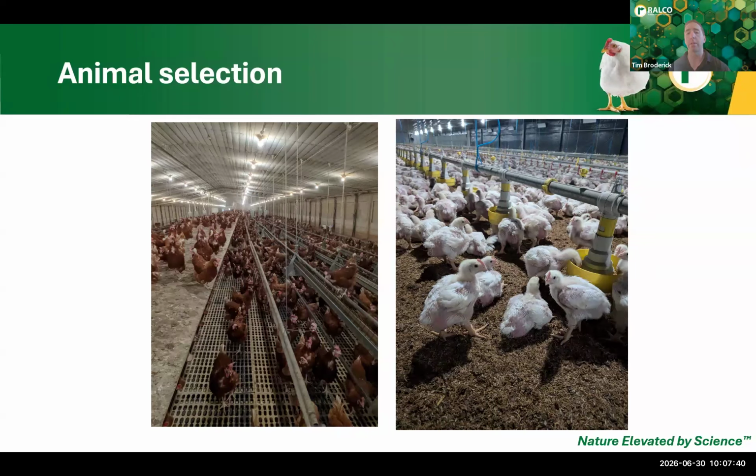But it's also important to grab 1 or 2 birds that we feel are healthy. A lot of these conditions, we'll say E. coli as an example, can operate as secondary challenges. So it's important to understand what the baseline health of the flock is. Are birds that appear healthy still exhibiting these same symptoms internally? And that helps give us a range when we look at understanding the dynamics of any particular challenge.